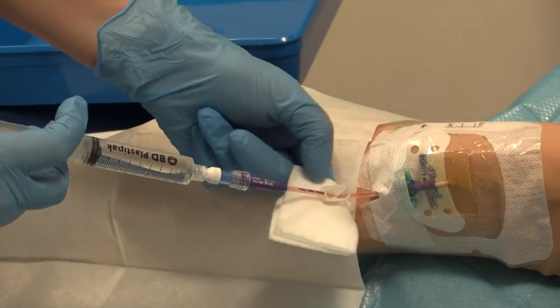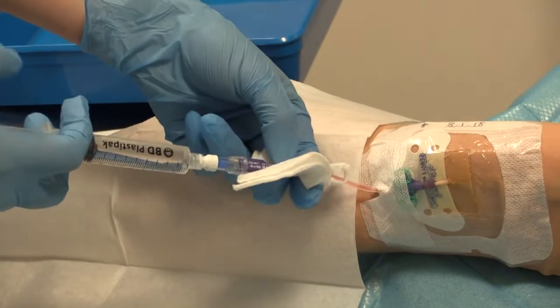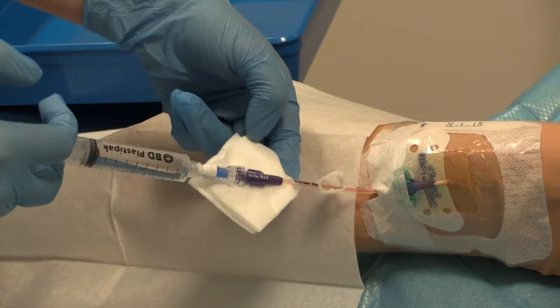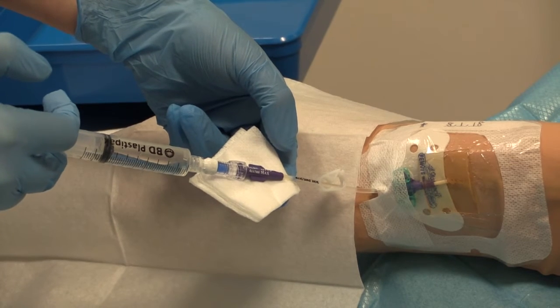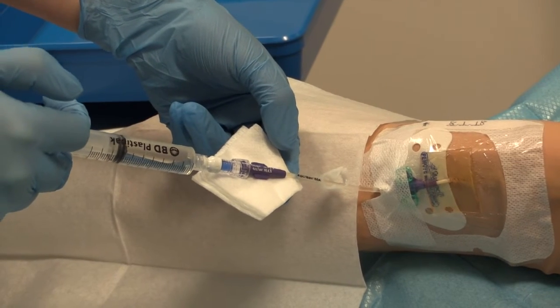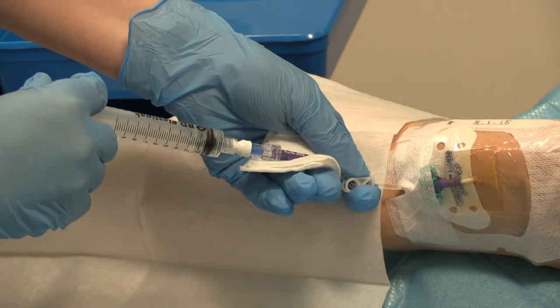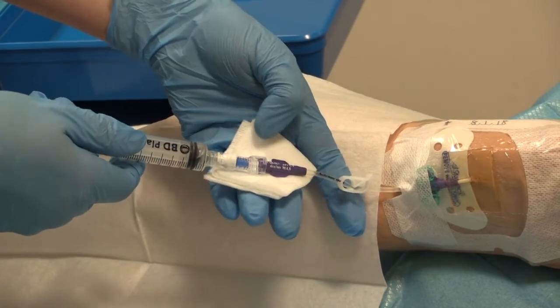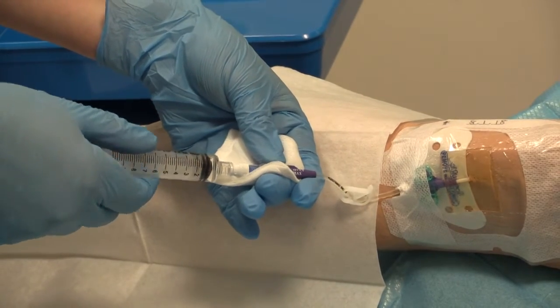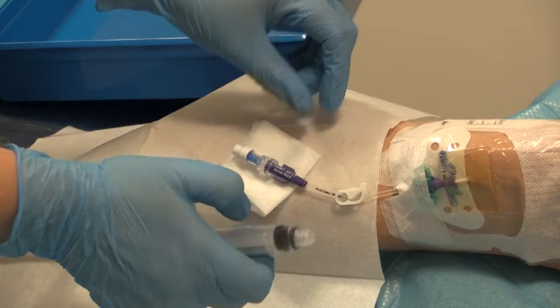Whilst applying some positive pressure, the line can be unclamped, and using a push-pause technique, the line can be flushed. During flushing, view the exit site for leaks and ask the patient how the flush feels. During the last one to two mils of flushing, re-clamp the line. This creates positive pressure and stops blood flowing back down the line. Disconnect the flush, leaving the needle-free device on the line port.